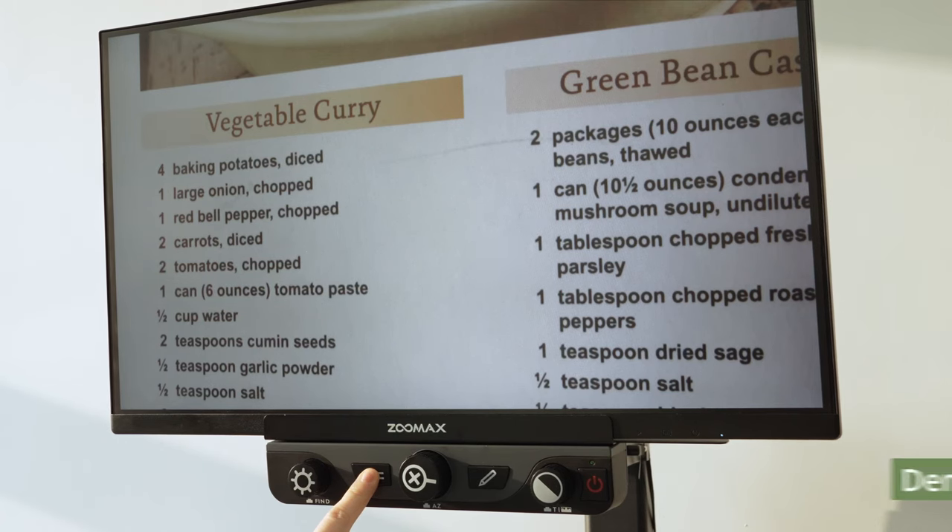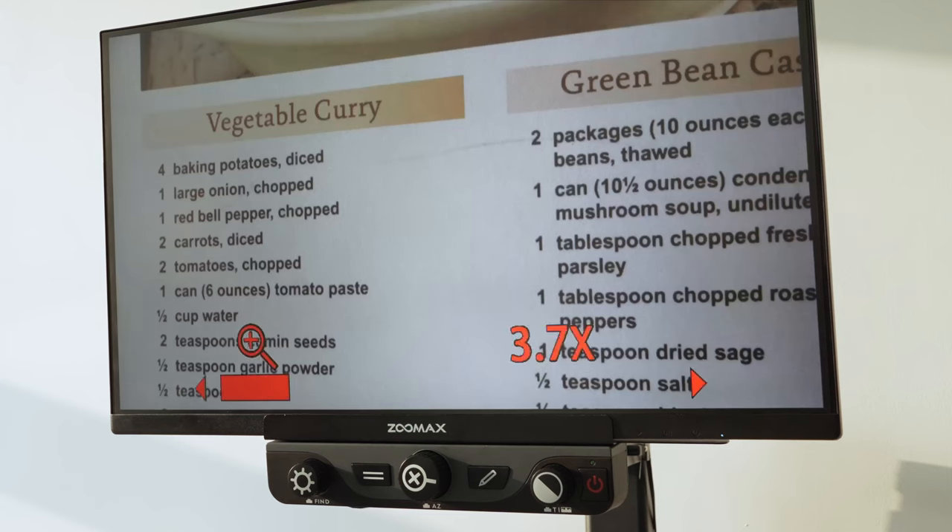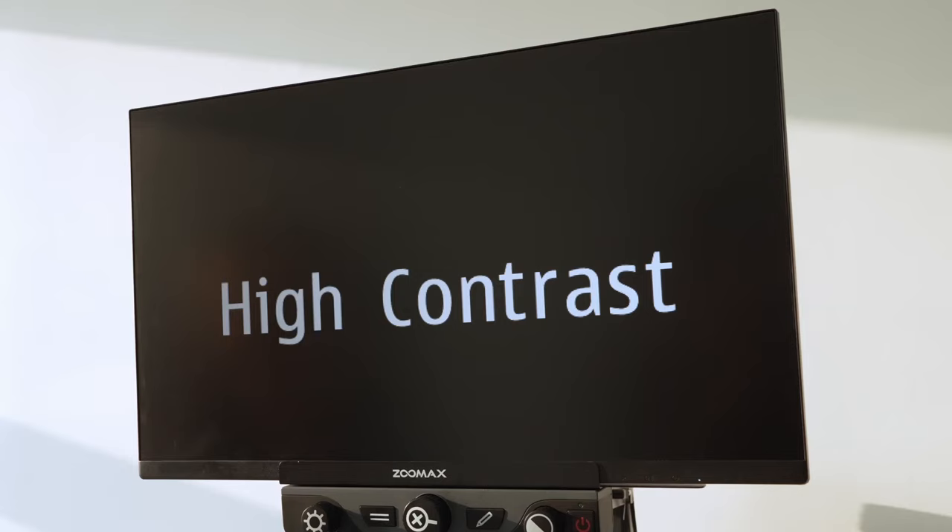Luna HD 24 Pro has a Demo Mode for people to learn the functions generally. You can access Demo Mode by long-pressing the Positioning Auxiliary button in the True Color Real-Time mode. Press the Power button if you wish to go back.